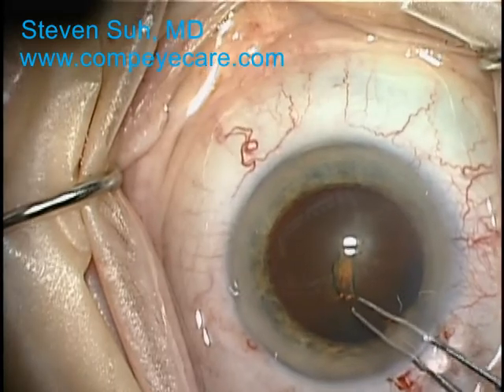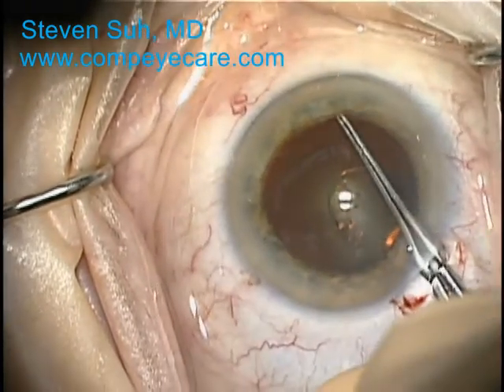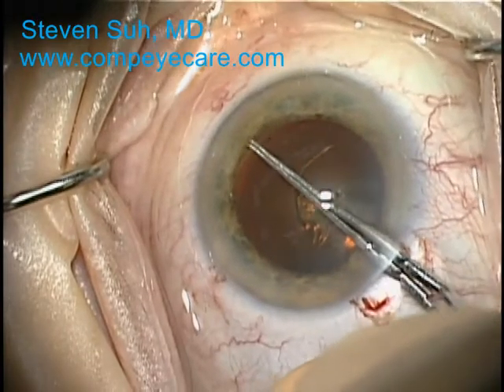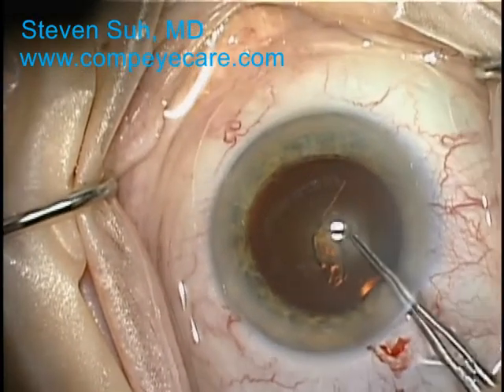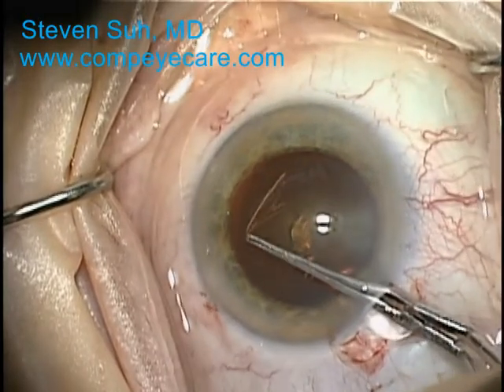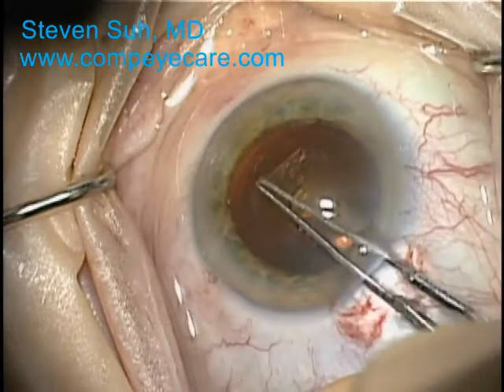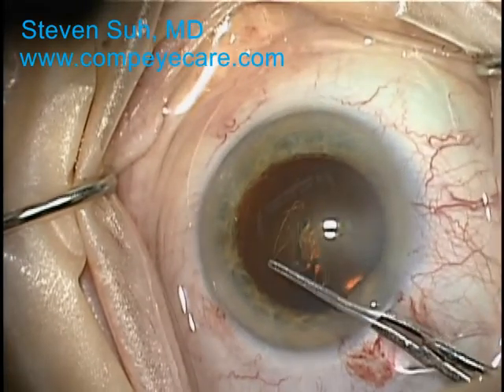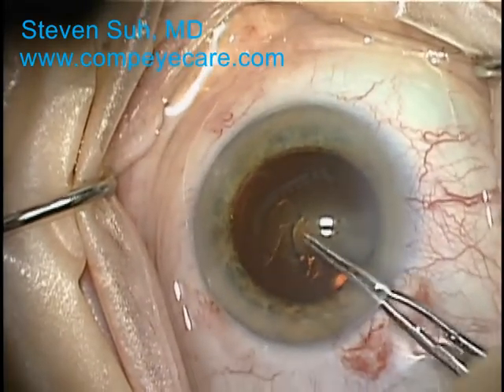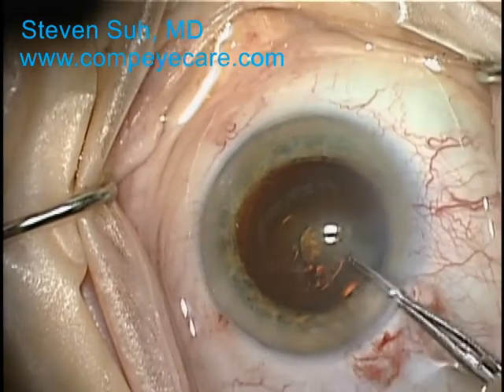I tell patients that this is an extremely important part of the procedure and that they need to keep still by staring at the light. Any sudden movements during this part can make the rest of the case more difficult. It is vital that this is a continuous circular opening to maximize its stability. This opening will give me access to the parts of the cloudy nuclear and cortical lens material that need to be removed.